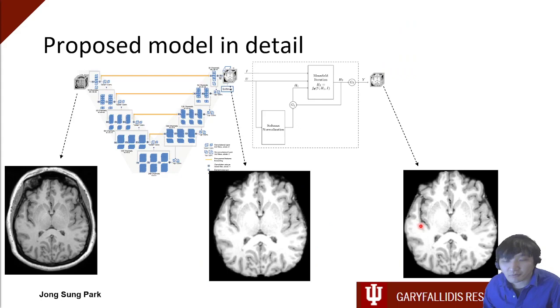So our proposed model is using the input T1 modality, the 3D volume, running it through a V-Net to get an initial segmentation result like this, which is good enough, but we refine it by using a CRF-as-RNN layer to remove some wrong segmentations and make it finer. In this part, you can see that it slightly has some segmentation of the CSF, which the CRF-as-RNN layer can remove.